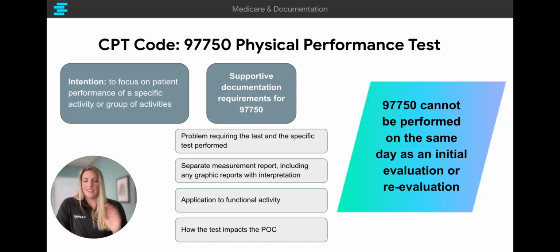So between all of that and symptom management, talking to parents, etc., I didn't really have time to do a full SWAY test, which was fine by me because I knew that I wanted to do that on the first follow-up. So on the second visit, if I could finagle my schedule so it wasn't overbooked in one hour, that's when I would administer the SWAY test, use this code on my second visit with my concussion patient.